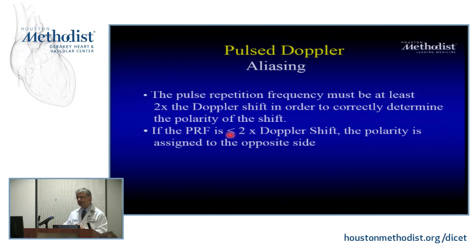Same thing if you look at, even nowadays, because the camera has a certain frequency, you see the wheels of a car moving, and then you see them rotating back. That used to be much more in the older days because the frame rate was not as fast. And nowadays, I think we have less of an issue because it's almost real time, right? So these are some examples of this situation.